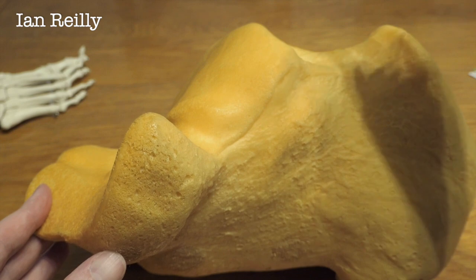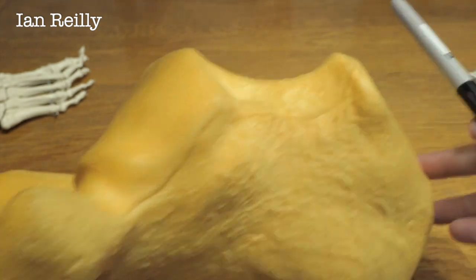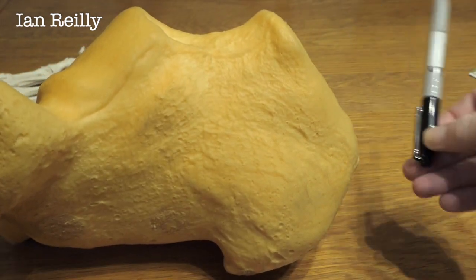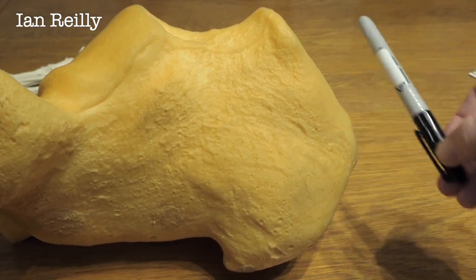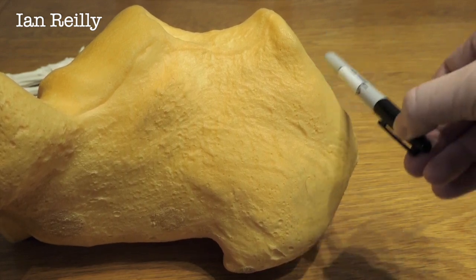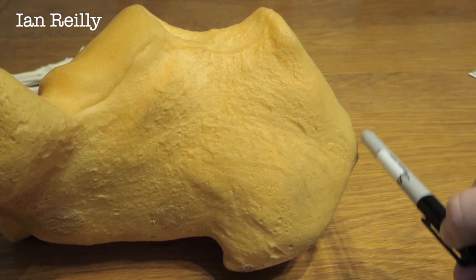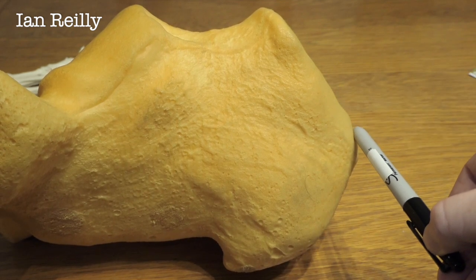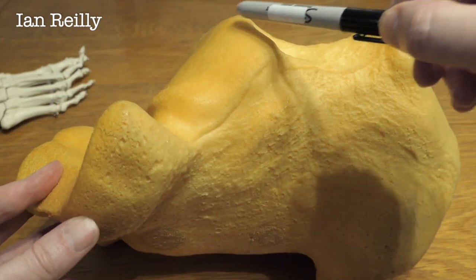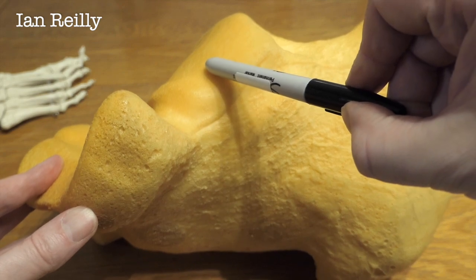Just as an FYI, your Kager's fat pad is here. This would be where you see your true Haglund's. This is where the Achilles inserts. This is where you would see the pre-Achilles bursa. This is where you get calcification into the TA, and this is where you get your retrocalcaneal exostosis. But for the purposes of this technique, we want to inject into this spot here, getting a needle round about there.